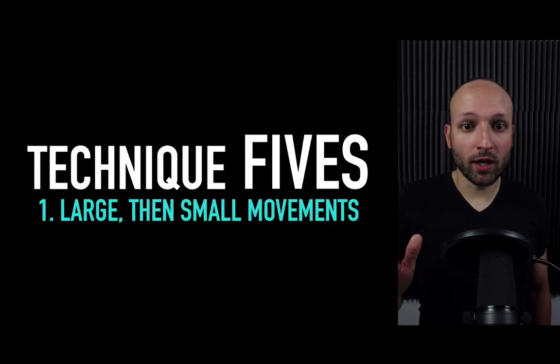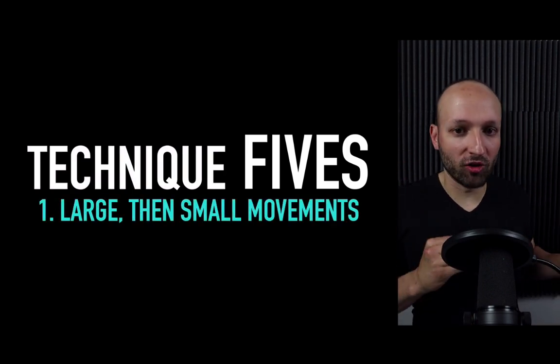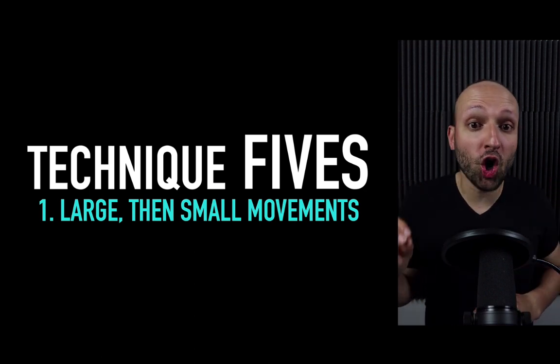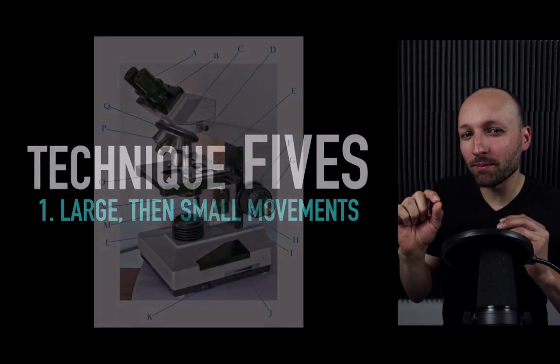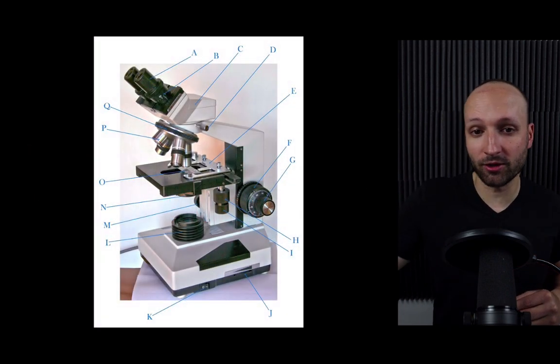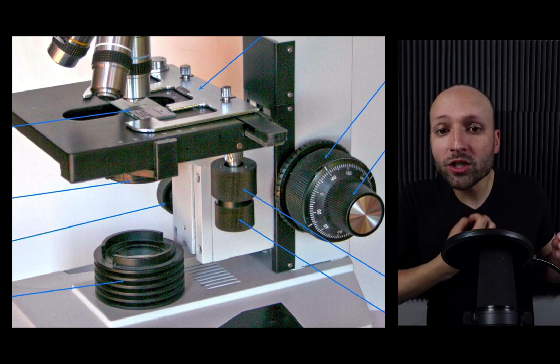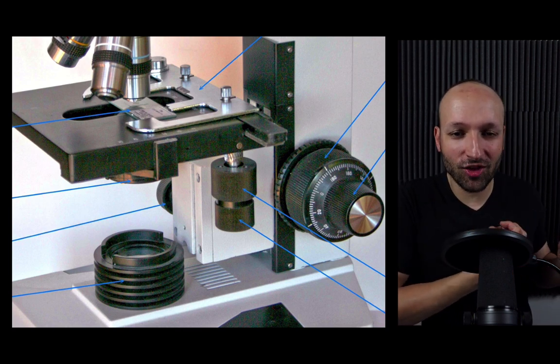All right, let's shift to some technique tips. You want to use large movements, then small movements with your ultrasound transducer. That's especially important when you're using cardiac ultrasound. Think about it like a microscope. You have a coarse tuner of a microscope, and then you have a fine tuner. Coarse, big movements until you see the thing that you want to see.